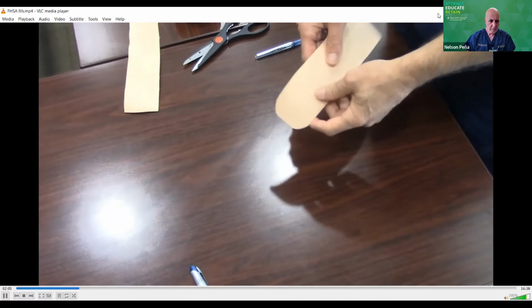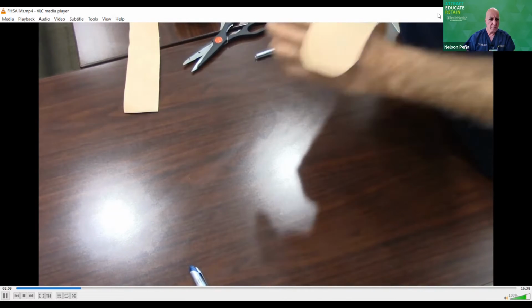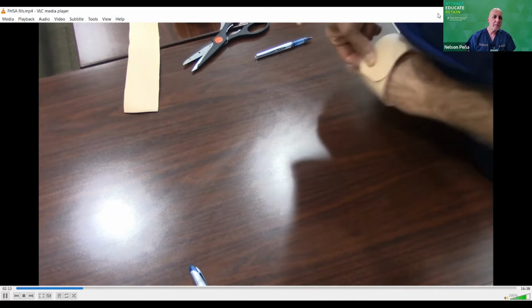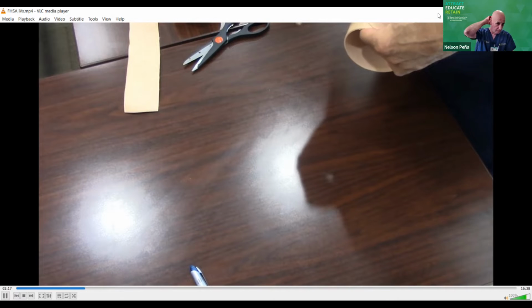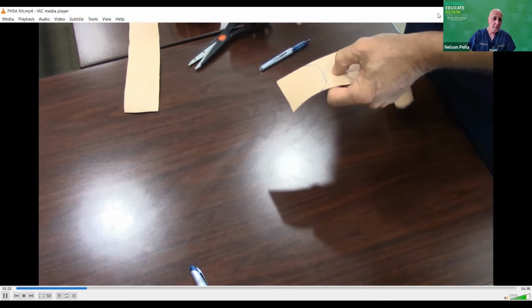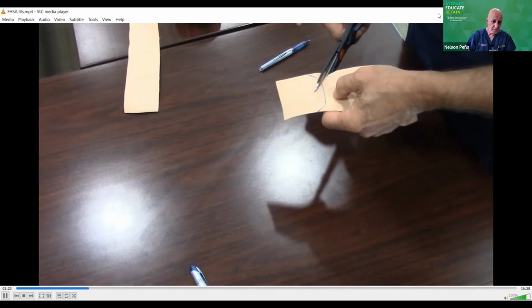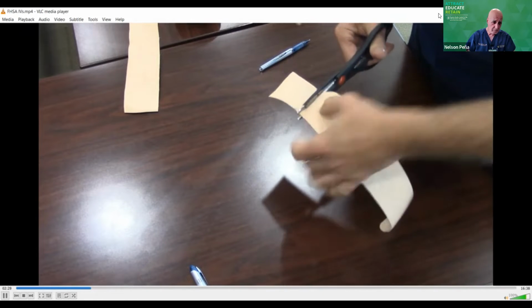Now, once you have the end of the strap nice and rounded, I usually just wrap it around my hand to mark it. And then I see that the mark is going to be right about here. So this is where I'm going to cut the other end. Of course, when I marked it, I did it backwards. So this time I'm going to correct it by going ahead and finish cutting the rest of the strap.